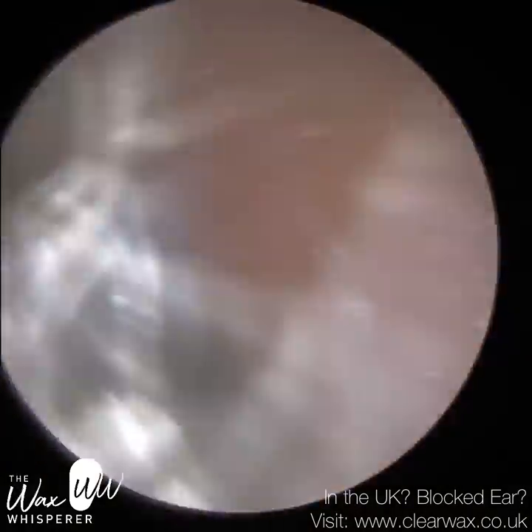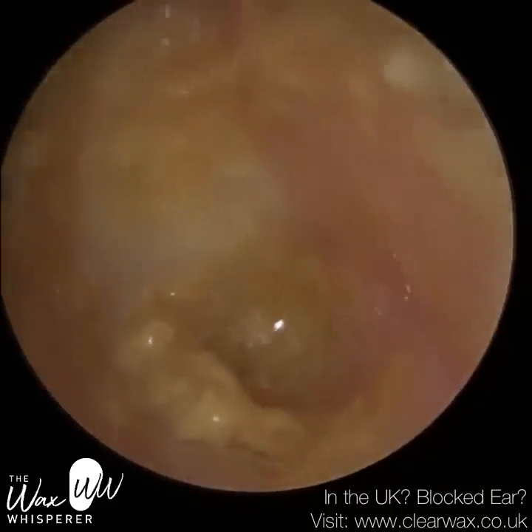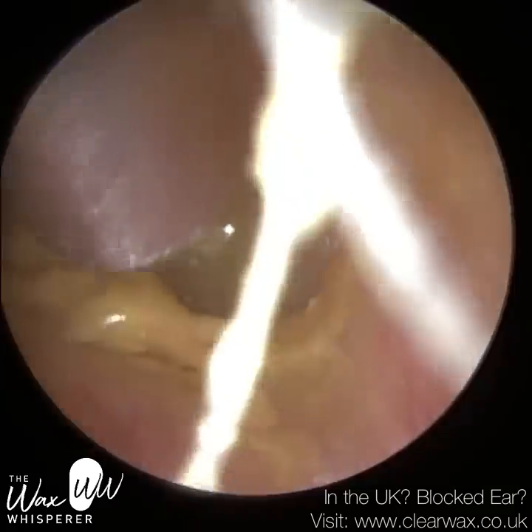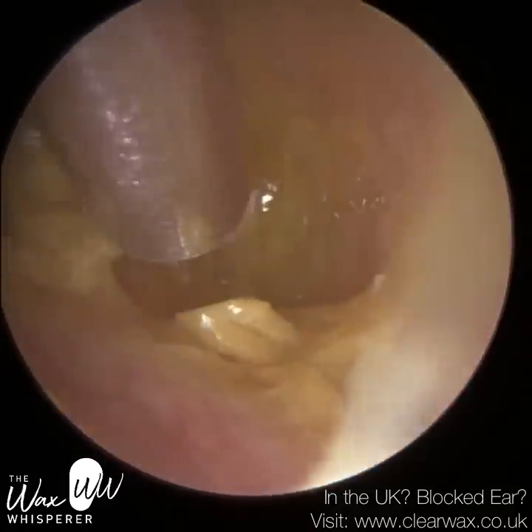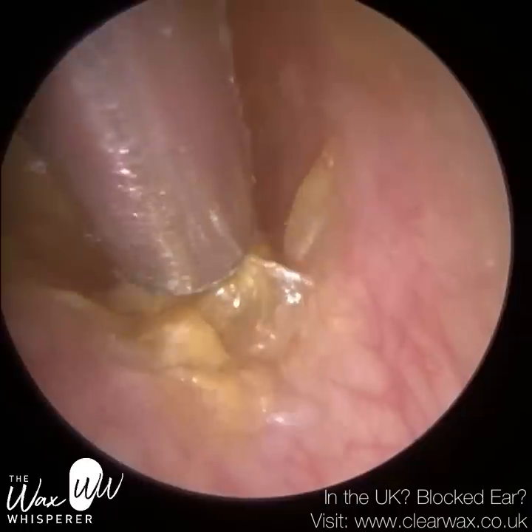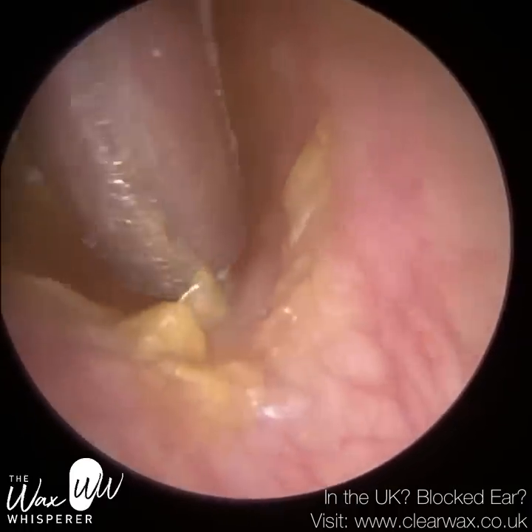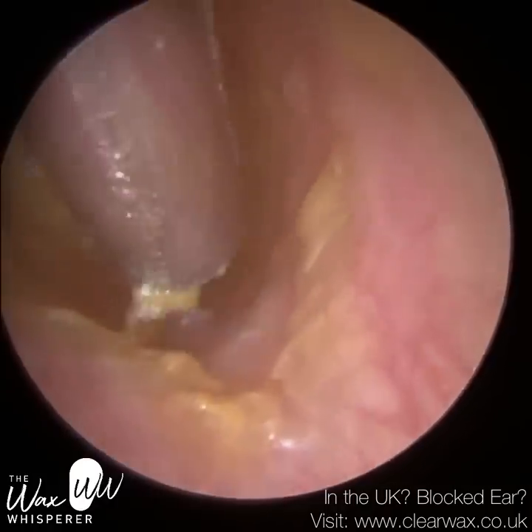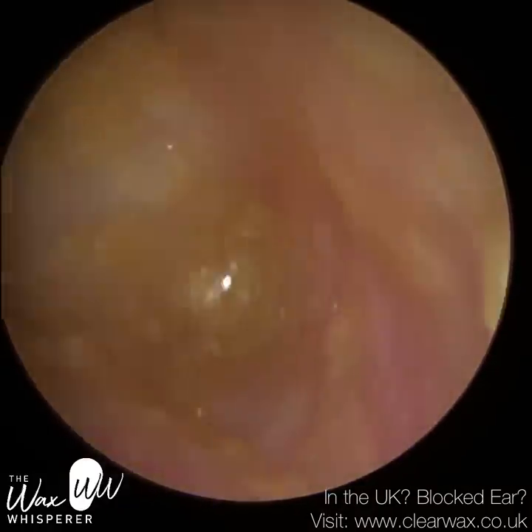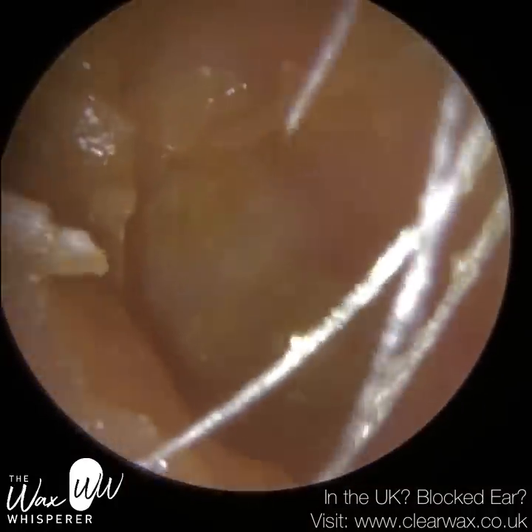So a false fundus is a false appearance of an eardrum, basically. And you can see it here now. I've put some drops in there just to bind all the sticky wax and skin together. Now, you can't actually see this patient's true eardrum because their true eardrum has been replaced by all this fibrous tissue. And what you're seeing there is actually a fake eardrum, hence the term false fundus.